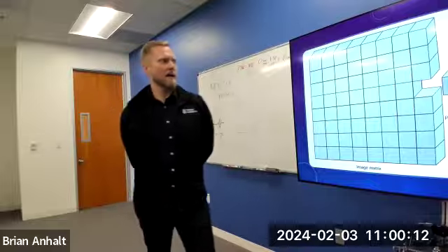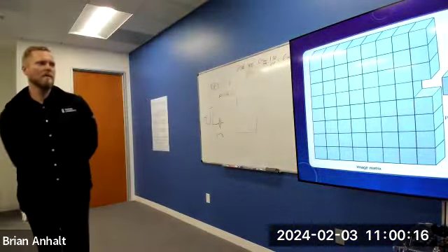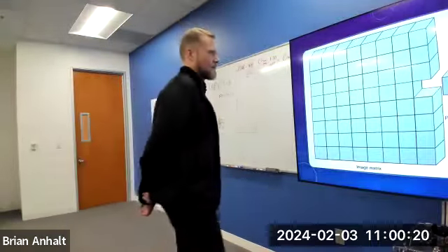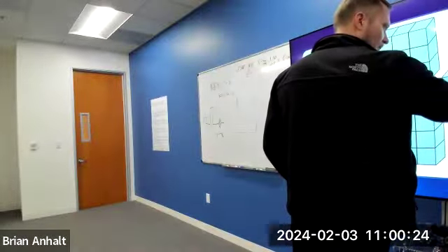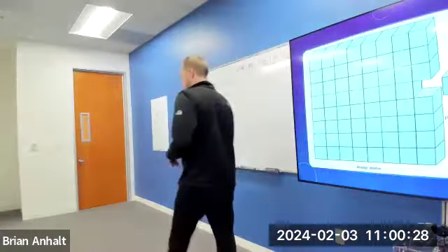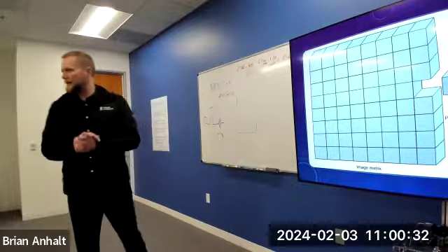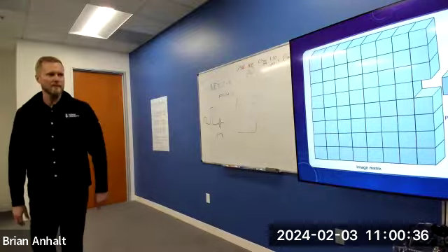In MRI, the brightness of the pixels is represented by the strength of the signal generated from the volume of tissue in that particular unit. So voxel is literally volume plus pixel. You get the word voxel. But note in MRI, we're looking at 2D images. We don't yet have these 3D images that are floating around us in 3D space, right? Even if it looks 3-dimensional, it's still a 2D image, right?